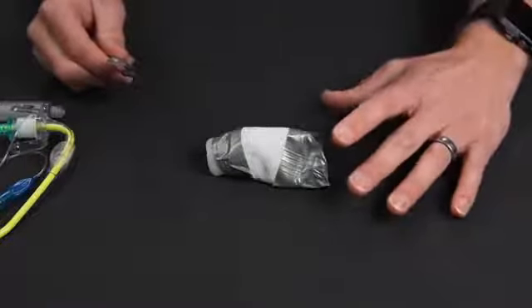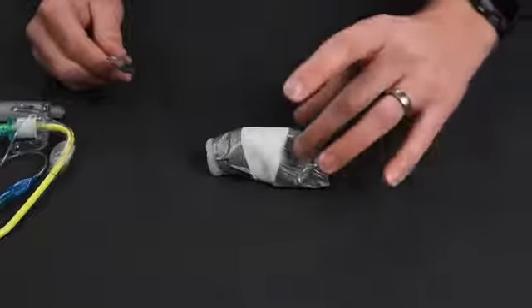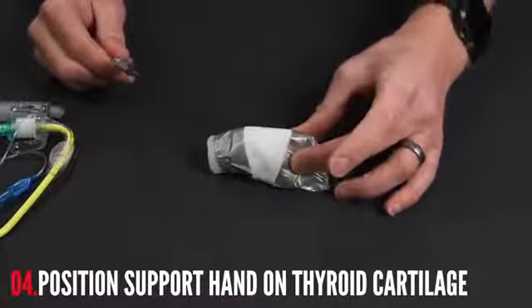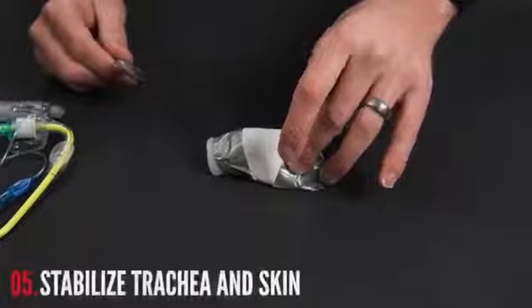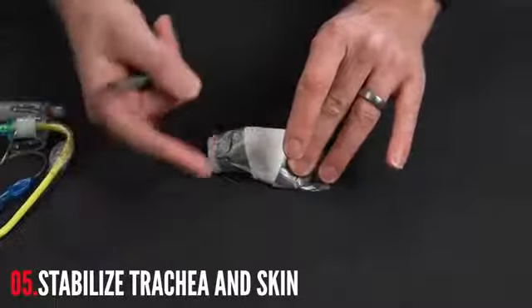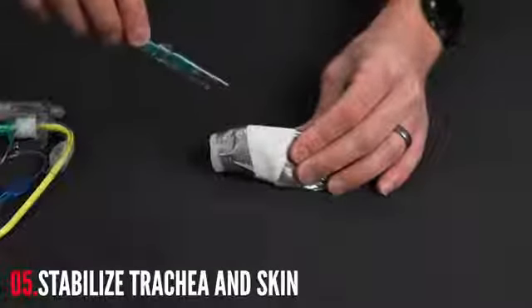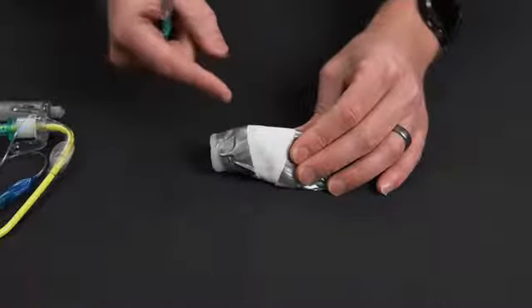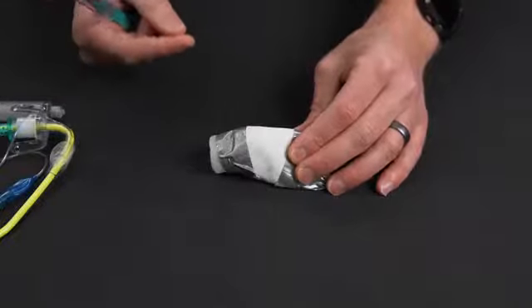So with my non-dominant hand, I'm going to take my middle finger and my thumb, and I'm going to find the actual thyroid cartilage. So that's the cartilage to either side of the Adam's apple. We're going to press down, and now this is to keep the skin and the trachea from moving irrespective of each other. It's dangerous when you create a cut through the skin. Sometimes the trachea will move and you'll actually lose the hole you put in the cricothyroid membrane, and it gets very hard to see when it starts to become bloody.